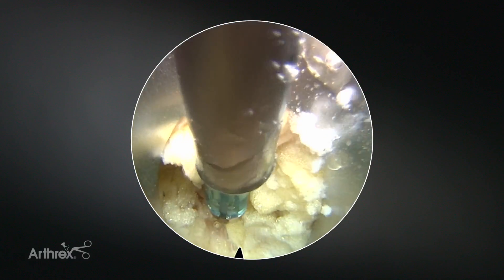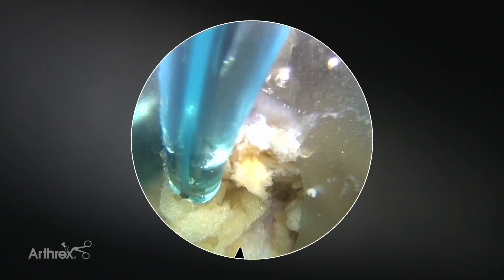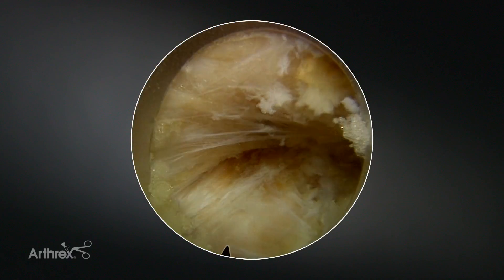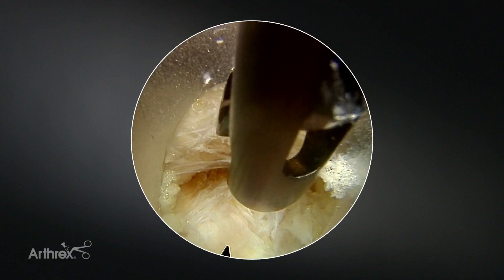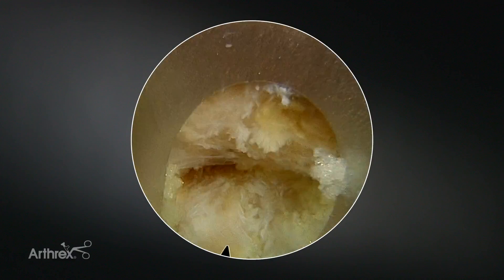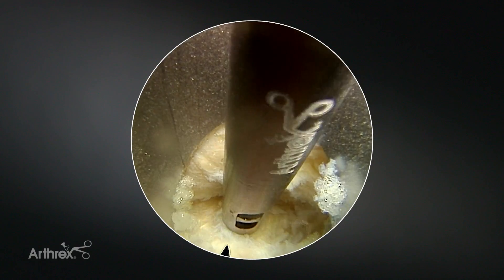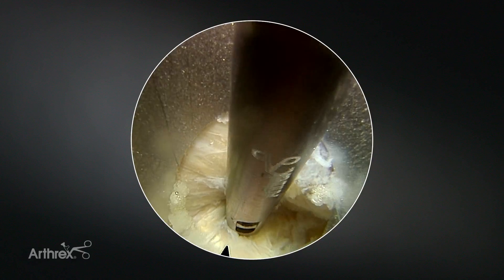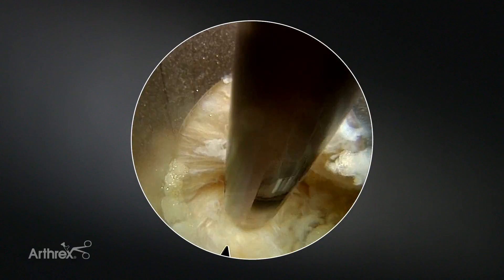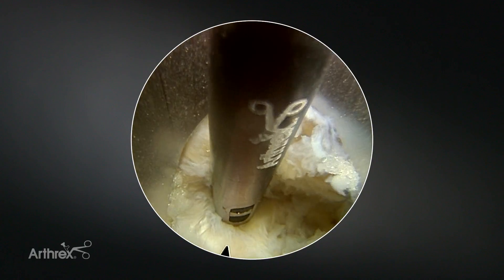This is epidural fat in the foramen. Our disc is going to be right here. I'm going to move caudally to feel for bone because that's going to be our pedicle. To our left, where my open jaw is, is the pedicle. At the top of the screen is the superior articular process. So this is our arch and this is our disc space — you can see I'm touching the disc right here on the x-ray. This squishy thing is the annulus right there. This is the end plate above, and this is the end plate below. You can palpate with the tip of your instrument and see that you're on bone, on bone, and have the squishy disc.